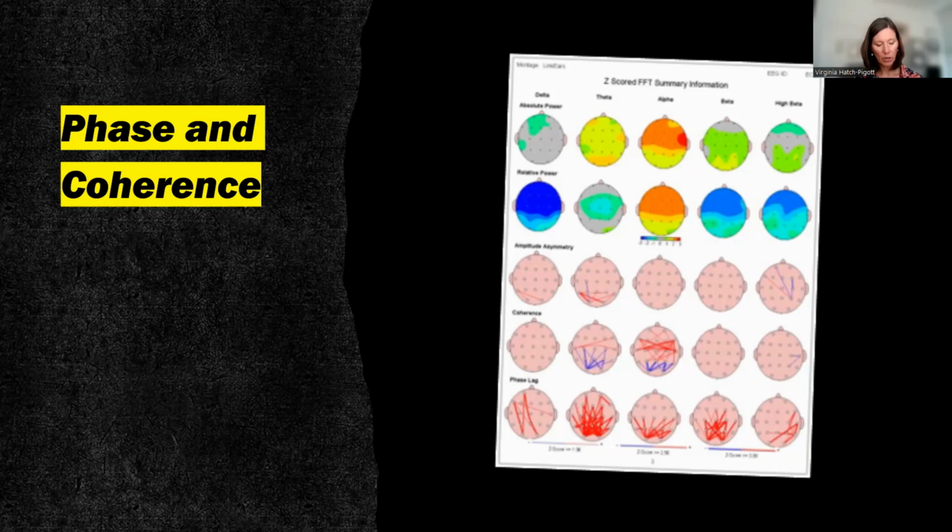Phase measurement reflects the correlation of covariance in time of activity at the 2 sites. And this temporal relationship can be slowed by damage to the white matter or the communication tracts due to demyelinating diseases, structural or toxic influences, or brain injury. The phase relationship may be faster with increased nerve conduction velocity, or volume conduction through fluids, and as a field effect.